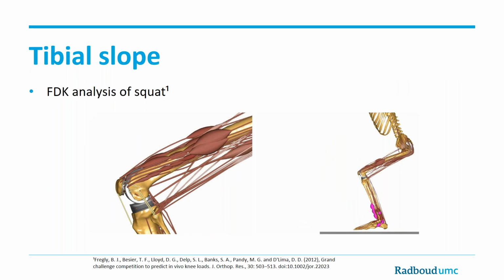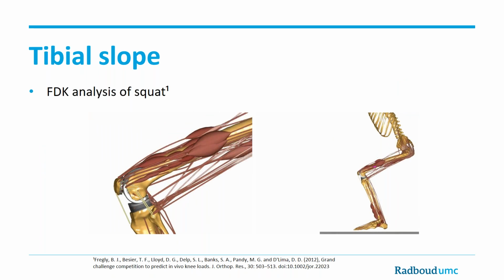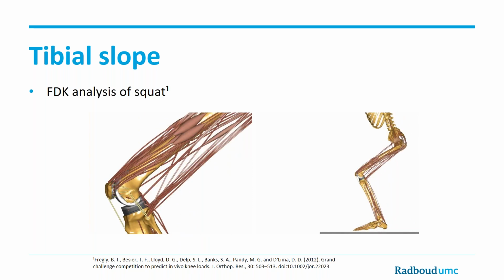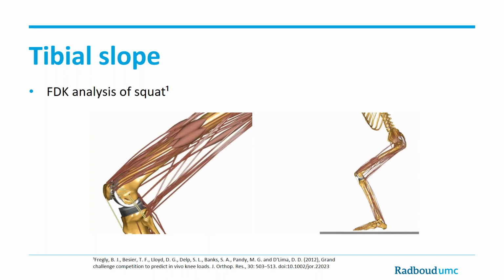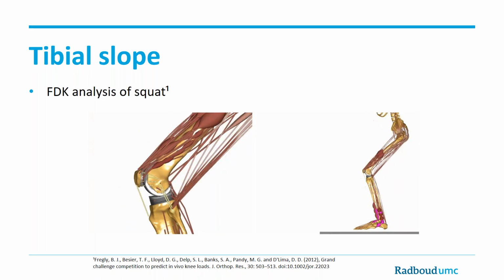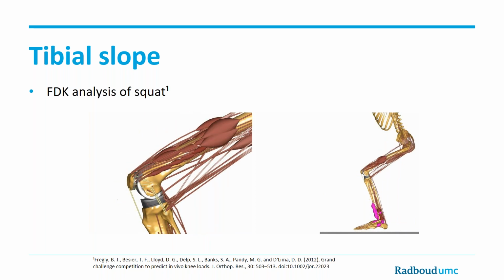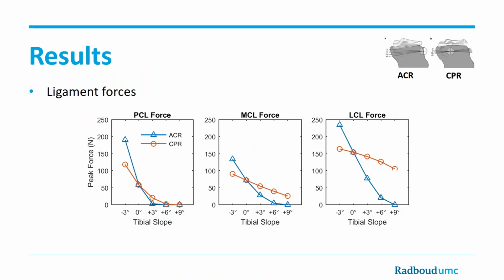So this was about laxity, but we were also interested in the actual performance during activities of daily living. So we simulated a quite demanding task. We simulated activities from the data set of the Grand Challenge, and we repeated the analysis with different slope configurations.